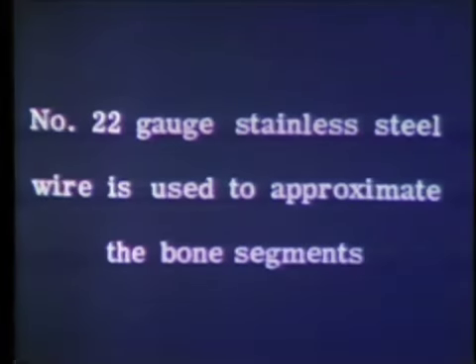You'll recall in the study of those casts that the fragment moves up and back. Therefore, these holes drilled with a surgical spear point drill with saline irrigation, as you have seen there, are not on the same horizontal plane, but they accommodate what will be the new horizontal plane between the two holes as the anterior fragment will be moving upward and backward.